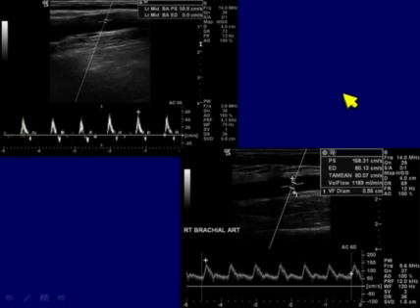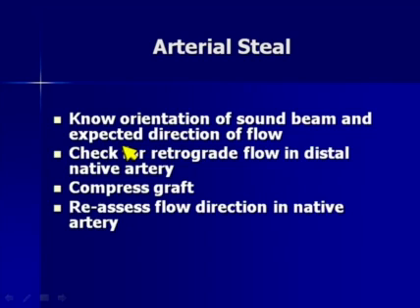If we're being asked to evaluate a hemodialysis access graft, and we start out and we are looking at the brachial artery, we see this kind of pattern, which is high resistance, we know that there's a problem already. This should be our flag to say, well, this is actually a good brachial artery Doppler signal, but it's not a good signal in a patient with a fistula. In a patient with a fistula, we need a low resistance signal because that fistula is created, and we should have lots of diastolic flow. So if you start out here, we're probably dealing with somebody with a thrombosed fistula.